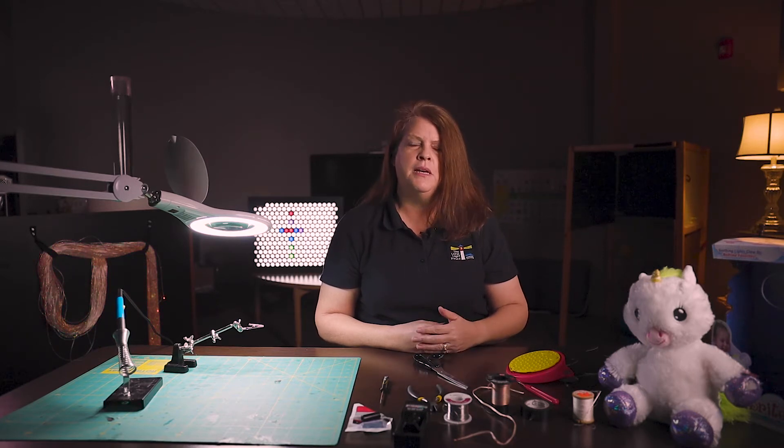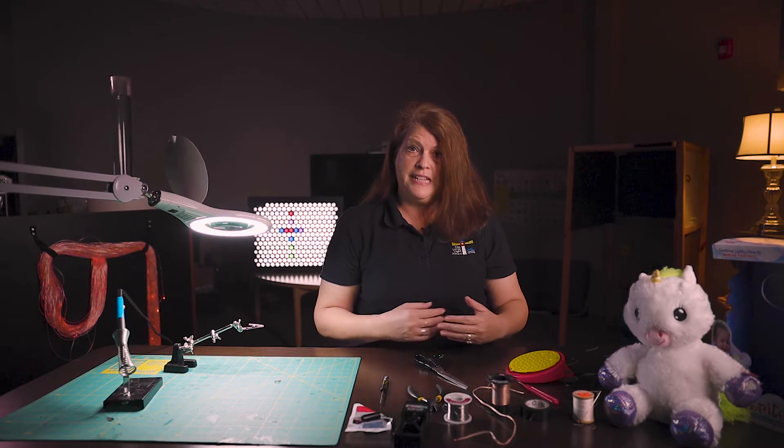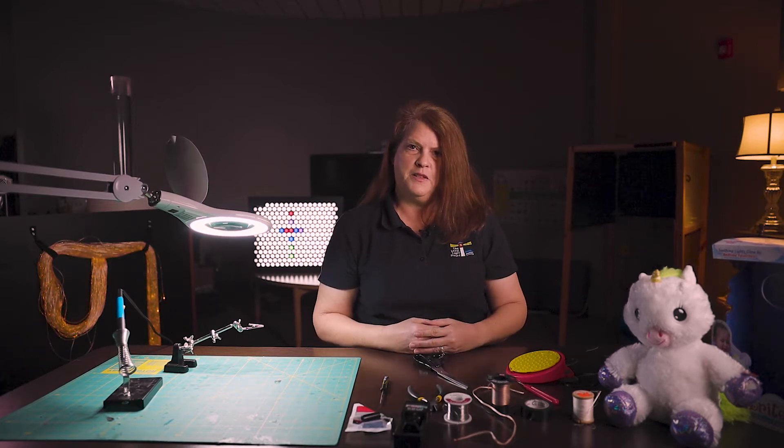It's very easy to do with just common things that you might have around the house, and it allows you to really customize what your child likes and what you know they're going to respond to. So let's get started and I will show you some of the items that you will need in order to set up before you actually start adapting the toy.